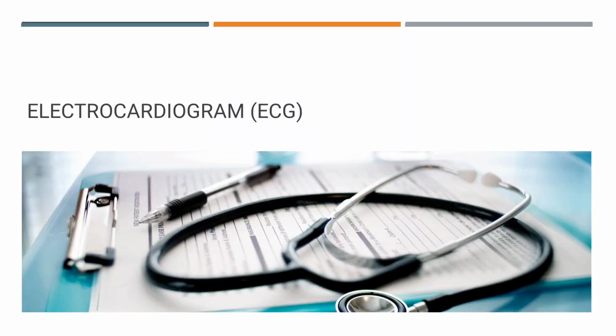Hi everyone. Have you ever asked why it is very difficult to interpret an ECG? Here is the answer. You need to know the basics of ECG, then only will it be easy to interpret the ECG. And what are the techniques? There are no techniques other than learning the basics and reading an ECG every time.